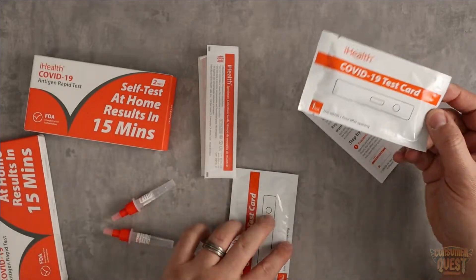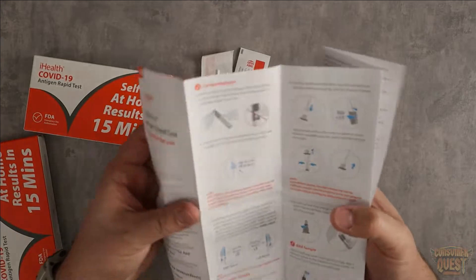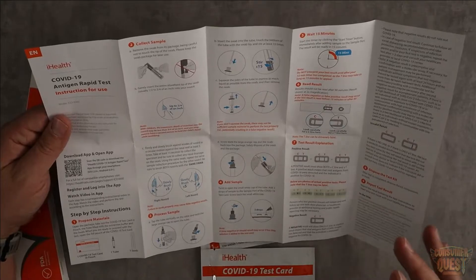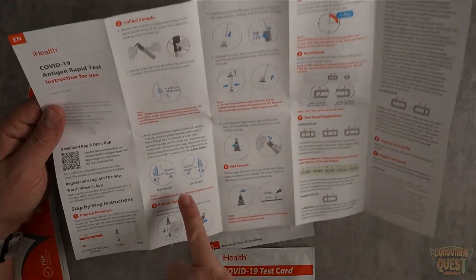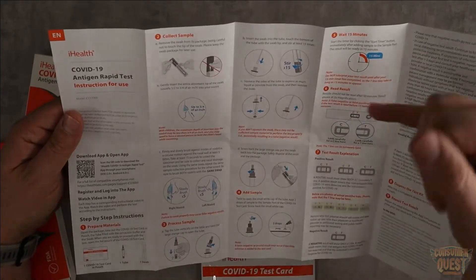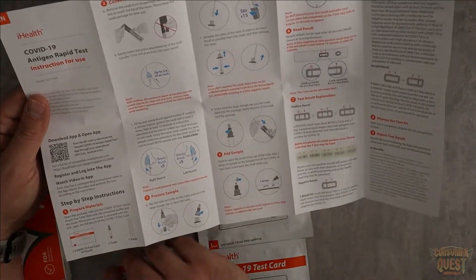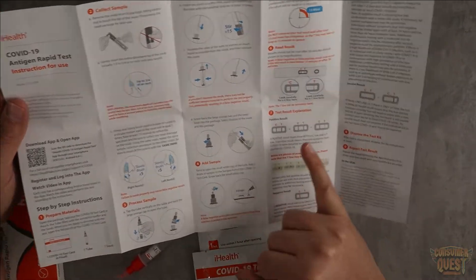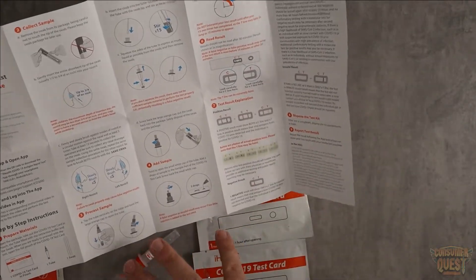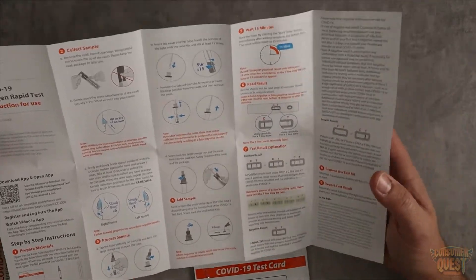Very straightforward and easy to use. If you look at the instruction manuals they walk you through the whole process. Some of these can be a little confusing, but this one looks really straightforward. You're going to swab slowly inside your nose, use the little dropper, then pop the stir stick inside the fluid capsule. You add the sample, put the drops of that mixture onto the test kit, and after about 15 minutes you'll have a positive or negative result.